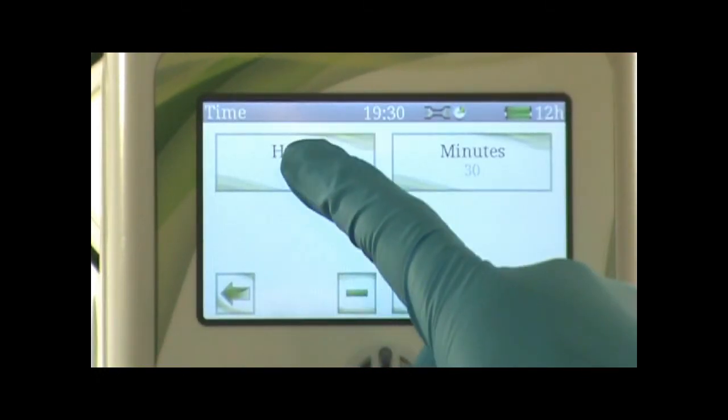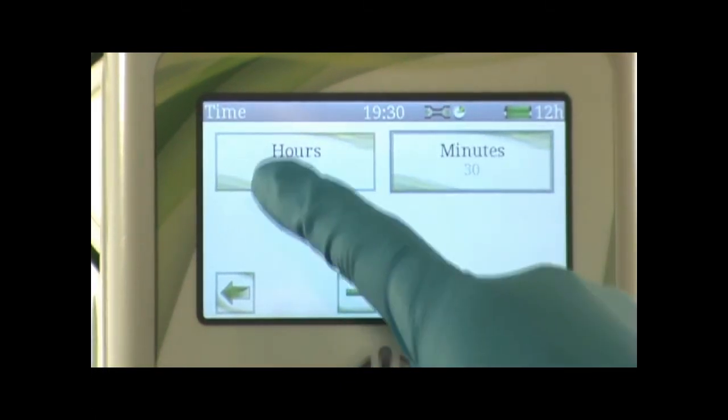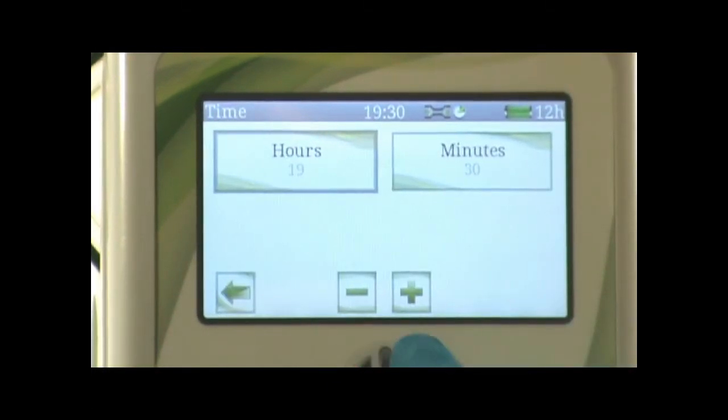Press time, then press the hours and the minutes, and you can adjust by pressing the plus and minus button.